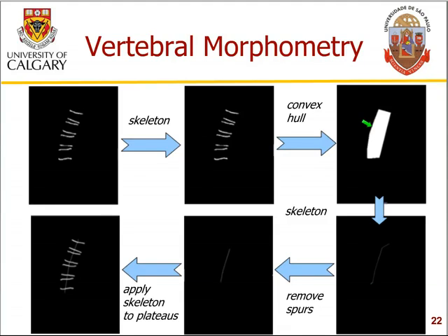Now, to this we apply a skeletonization procedure, and it may be difficult for you to see unless you zoom the PDF file. There is a single pixel thick line here, which would be the medial axis that runs along the center of the convex hull, such that it is equidistant from the edges. So it is the central line of the convex hull, which is shown here. And at the edges of the skeleton, there could be lines that are not of interest because they connect to the corner points.